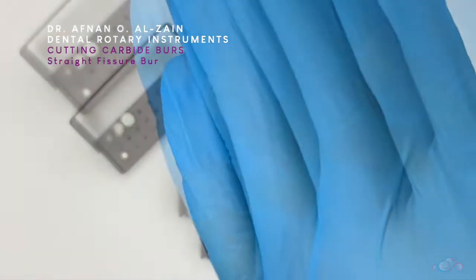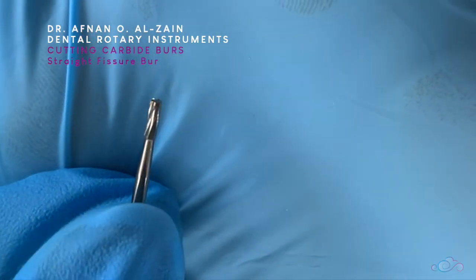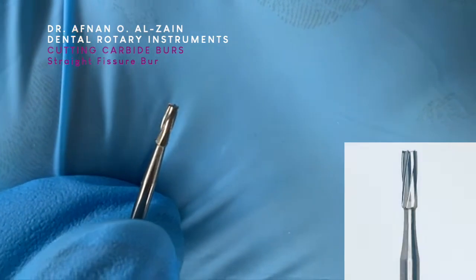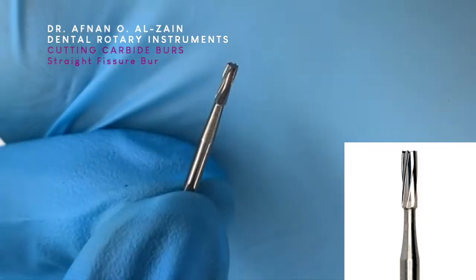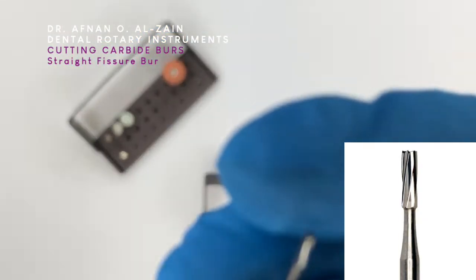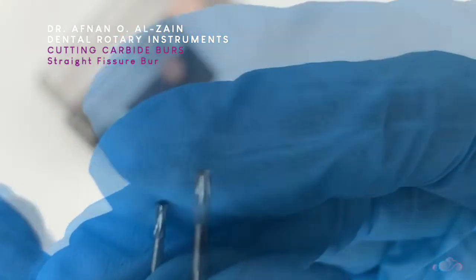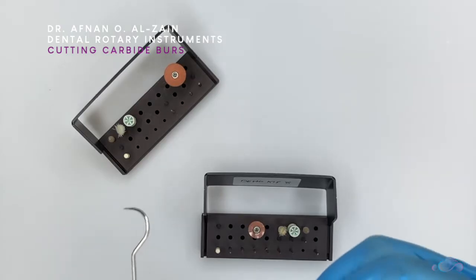Let's start first with cutting carbide burrs. This first one is a straight fissure burr — it is cylindrical in shape. You can see the flutes on the head. So we can see it is cylindrical in shape, and the cutting parts on the head are called the flutes. So these are the flutes of the burr.